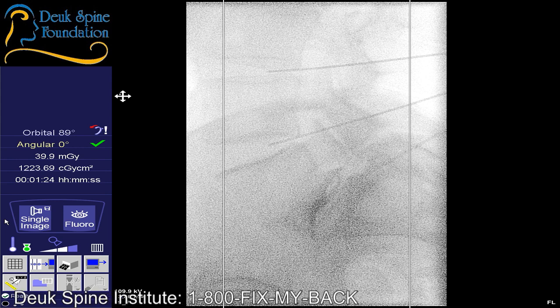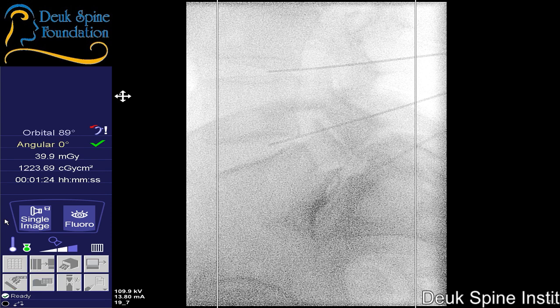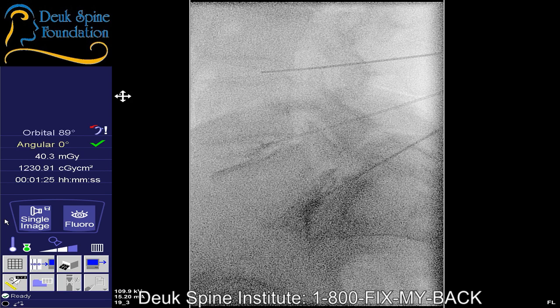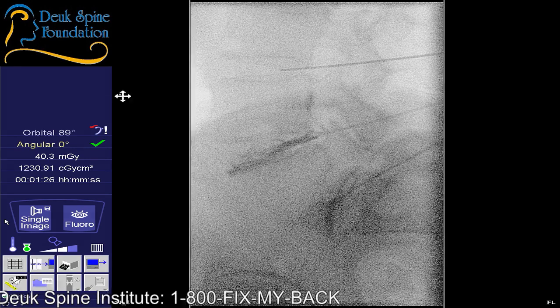All right. I need the next tube. Yeah, more than one, right? Yes, sir. All righty. You still comfortable? Good, we're in the disc. I need to see the front of the disc. I don't need to see the back. I need to see the front. There we go. All right. That's exactly right.